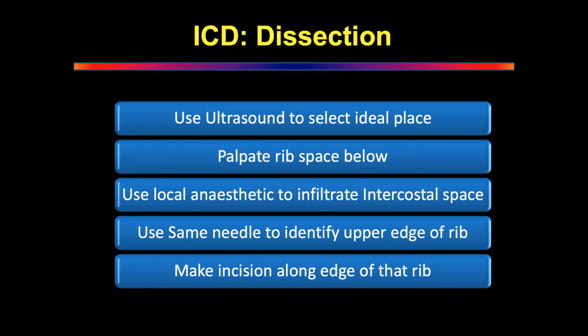What is the left hand doing? The left hand is fixing the tip of the arterial forceps, so it will be a controlled penetration to the pleura.